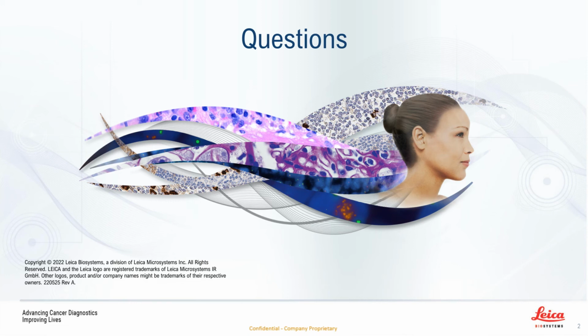And as much as possible, bring them close together, which I touched on, as that is going to give you a smaller scan area, a smaller file size, and faster throughput overall for your scanners. So I wouldn't necessarily recommend changing away from some of the practices on how tissue is presented, but rather ask whether there are steps that can be done to optimize those processes.